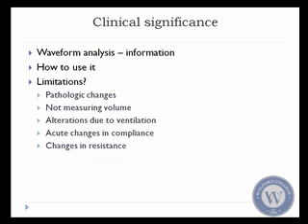Waveform analysis gives you a lot of information, and you need to learn how to use it. One of the things that I begin to teach my students in clinical is that you need to look at the waveforms before you start looking at the numbers. Numbers don't mean anything if you don't understand what the waveforms are trying to tell you. Sometimes you'll have valvular abnormalities that are screaming at you, and a lot of people just look at the numbers and don't pay attention to the waveforms, and as a consequence make many clinical errors. When we tie this in with valvular abnormalities, that'll become more clear to you, hopefully, and hopefully you'll try to explain it to other people so they can use these modalities a little bit more efficiently.